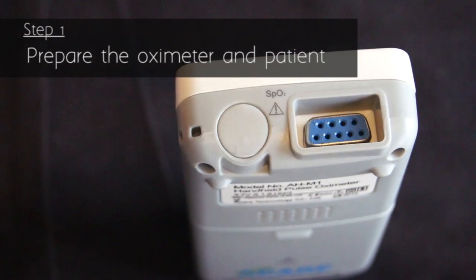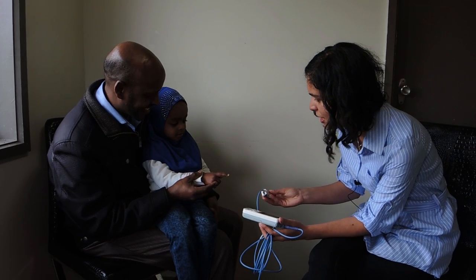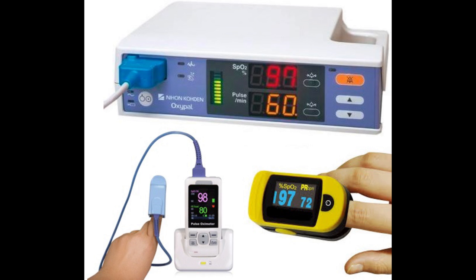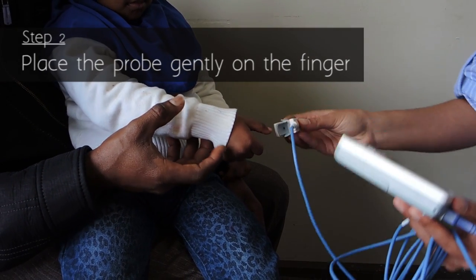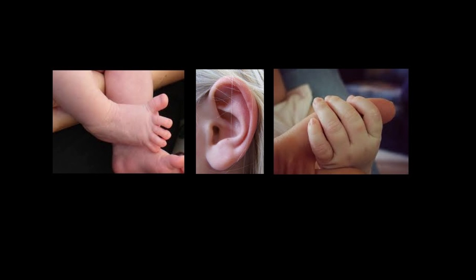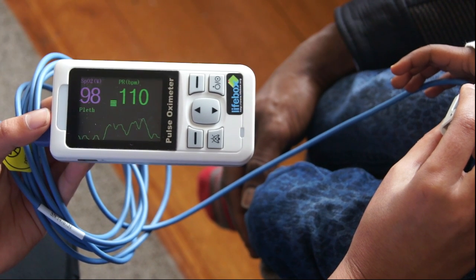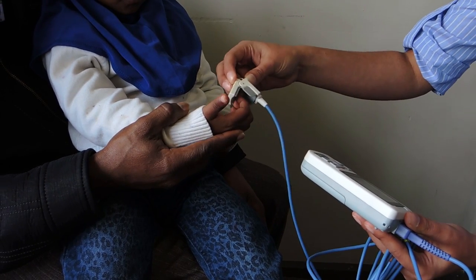Now we will discuss each of the important steps individually. Check that the oximeter is plugged in and working. Introduce yourself and show the child and parent the pulse oximeter, explaining what you are doing. Oximeters may be handheld, desktop, or fingertip. Place the oximeter probe gently on the finger and wait. You can hold the child's arm gently but do not squeeze the finger. Probes can also be used on the toe or ear. Wait until the oximeter shows a good pulse waveform — this may take some time. You can also palpate the pulse and check that it matches the pulse indicator. If there is a poor trace, try repositioning or changing to a different finger.